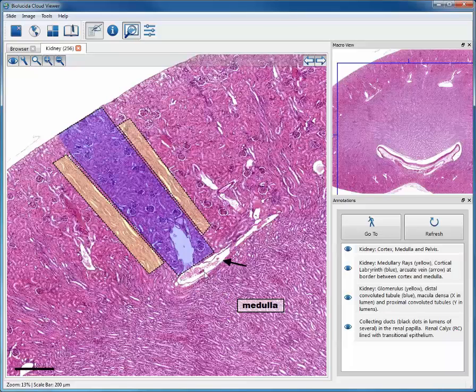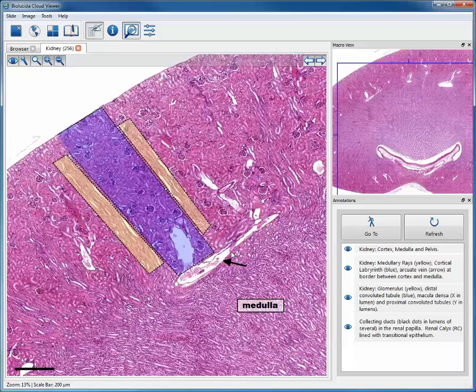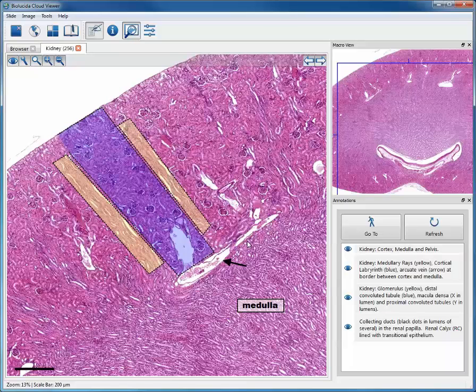And this is a vessel. Here is an arcuate vein. If we were to be able to see at a different level in this same region, we would see the arcuate artery. The arcuate vein collects blood from the cortex and the medulla, and the arcuate artery provides blood flow to the cortex and to the medulla.